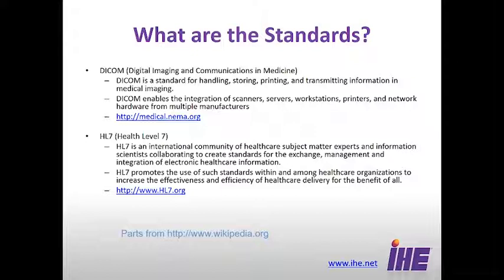What we do is we try to refine it. An example from DICOM is DICOM may say you can do something using one method or using a second method. Well, if one system uses the first method and the other system uses the second method, they may not communicate all that information accurately because they're using two different methods of transmitting that information. In IHE, we refine that, so if you're IHE compliant, it's one set of specific information that's being transmitted, and the information has specific meanings. It's not open to interpretation.